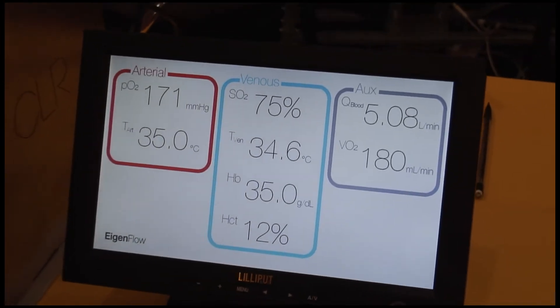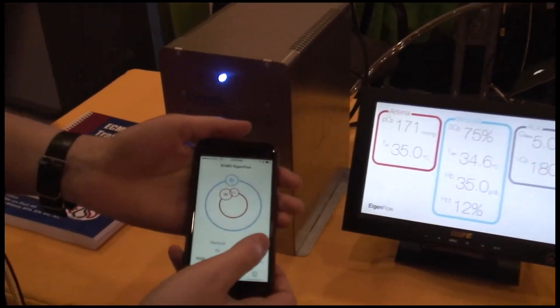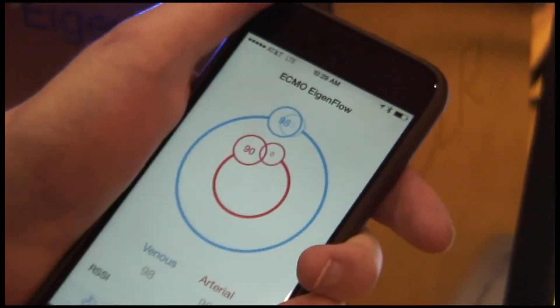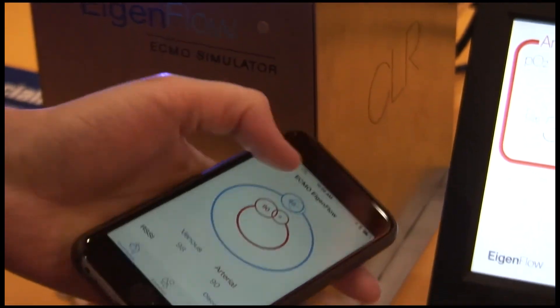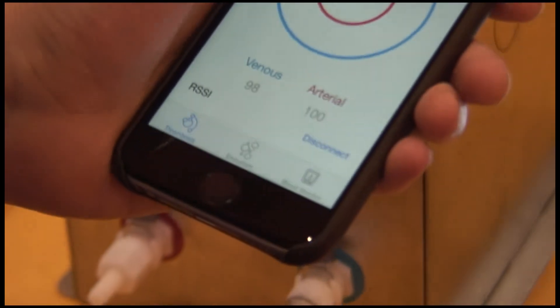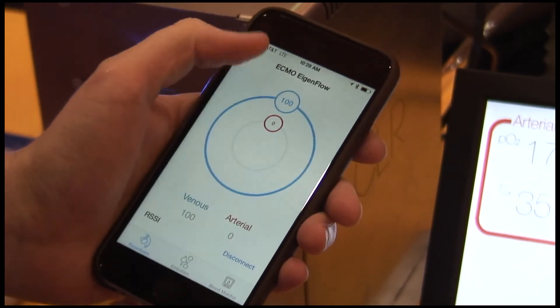Everything is controlled on this box through an iPhone app that we have developed. With one hand you can fully operate the eigenflow — adjusting down here at the bottom, we're looking at thrombosis, which are blood clots. We can have the circuit completely open, partially obstructed, or fully obstructed, which would be zero.